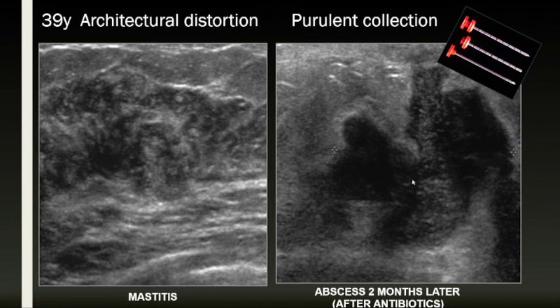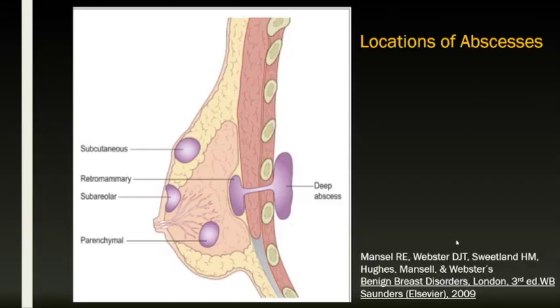But for an abscess of this size, you could use this, remove the stylet, attach tubing, and then a syringe at the end of the tubing, and try to aspirate the fluid. These are stiff, and as metallic devices, they probably are less likely to occlude with the material that you're withdrawing. But it's just one of many ways to do the abscess drainage.